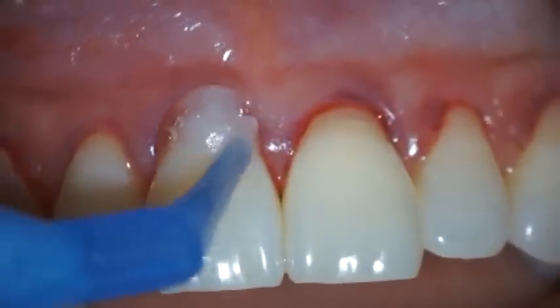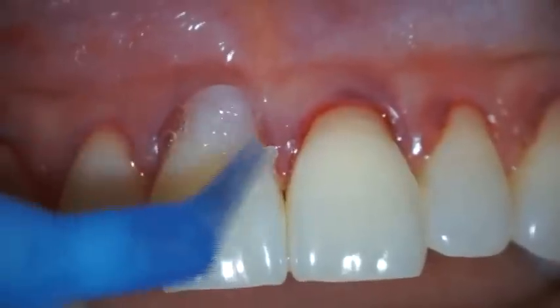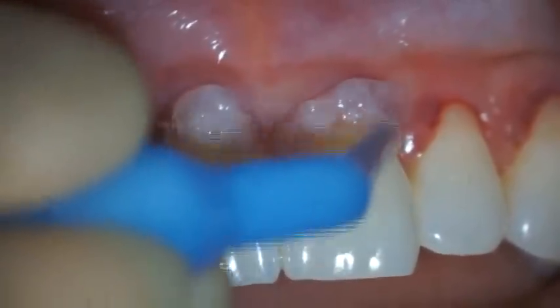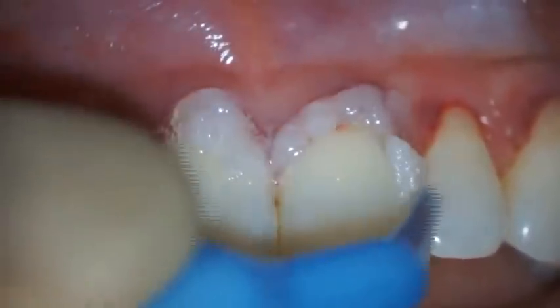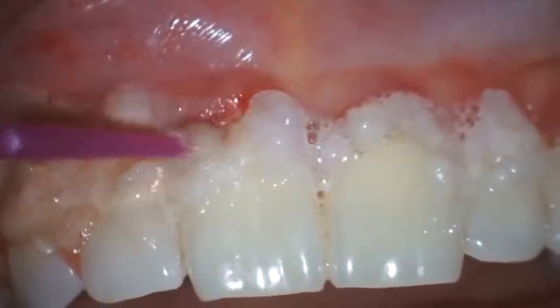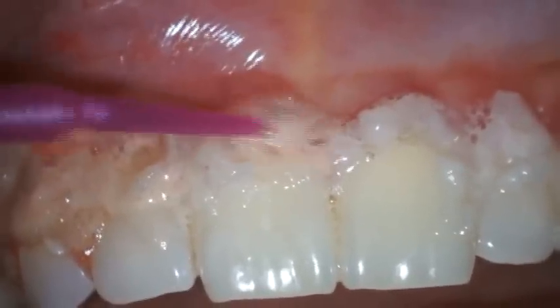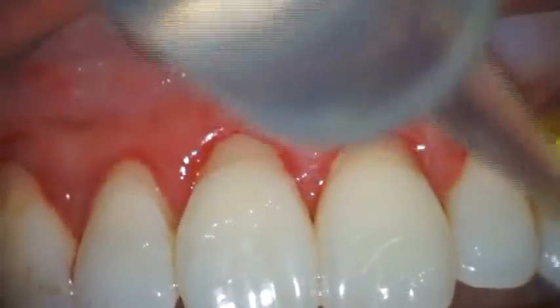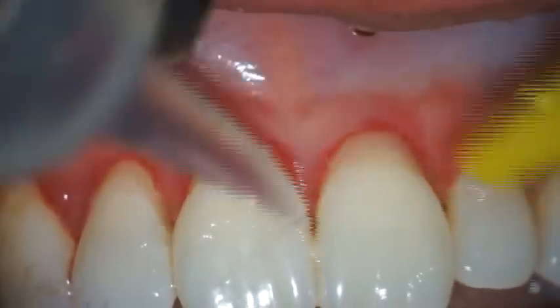The roots are then conditioned for three minutes with 24% buffered EDTA gel in order to eliminate the bacterial smear layer, any root surface toxins, and to expose collagen fibers. EDTA is burnished into the root surfaces to improve its root conditioning effectiveness. Sterile saline is then used to thoroughly rinse the EDTA gel from the surgical field.